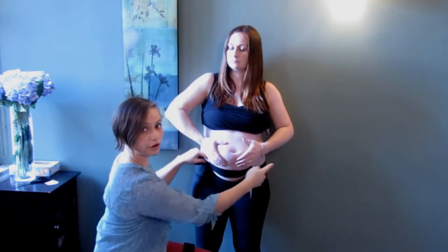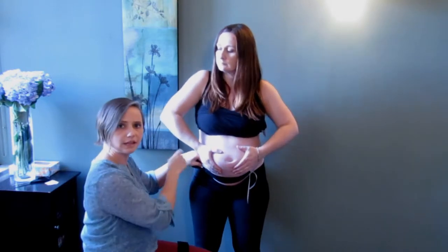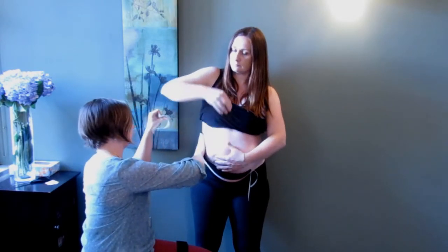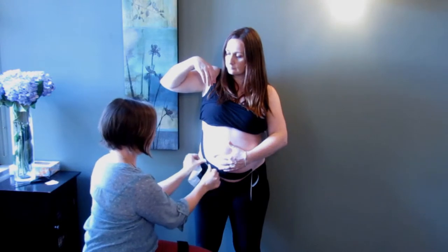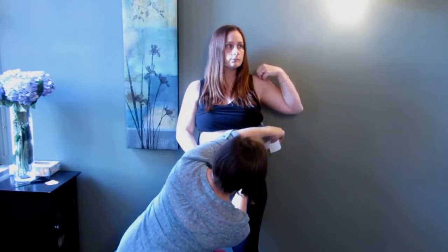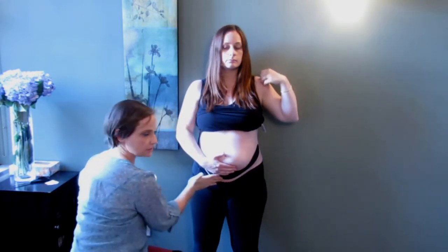The outer thirds will have no tension on them. You're going to angle back to anchor on the ribcage. Trying to make sure there are no creases or folds. Give it a little rub so that it'll stick better.